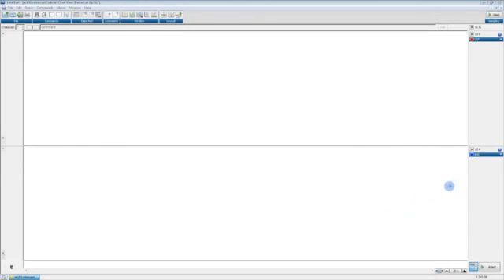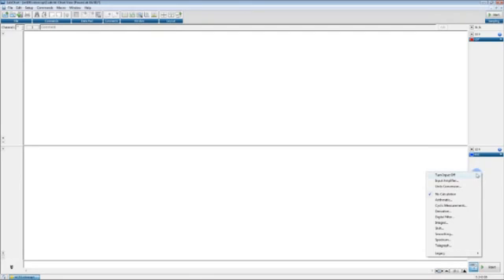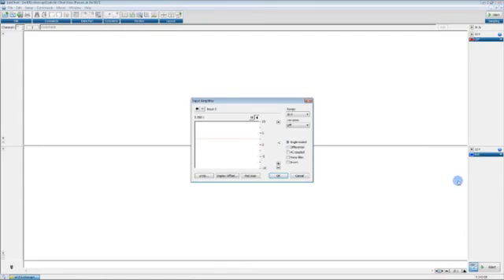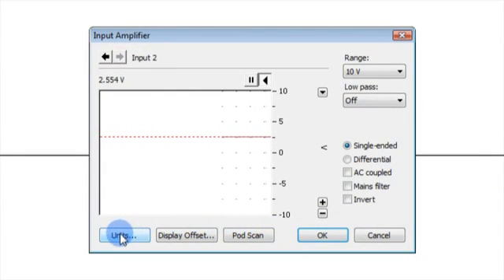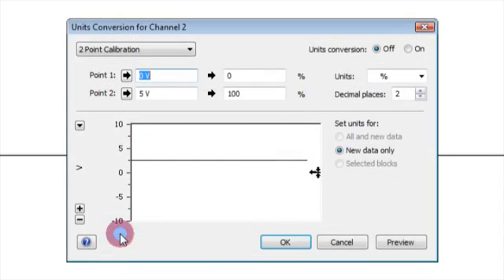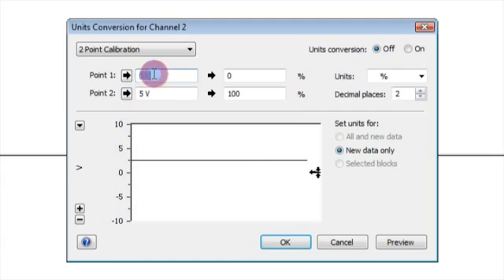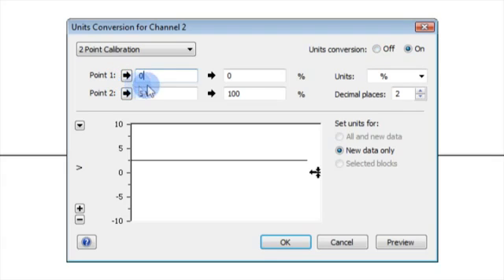To apply units conversion to the backscatter signal, firstly, open the input amplifier dialog for the backscatter channel in LabChart channel calculations. Then, click the units button to open the units conversion dialog, and set a two-point calibration where 0 to 5 volts corresponds to 0 to 100%.